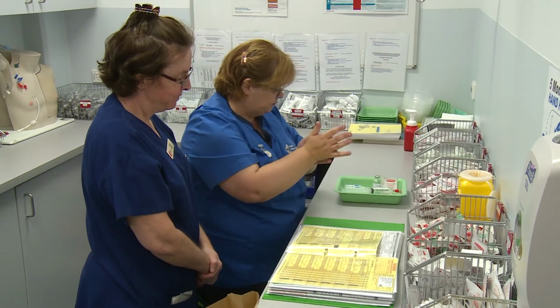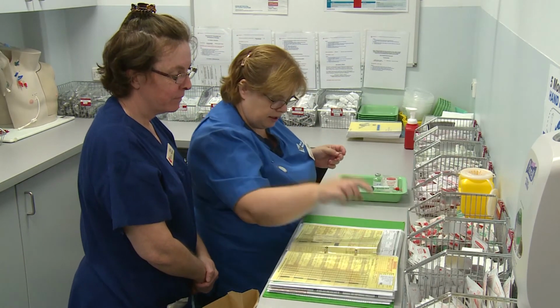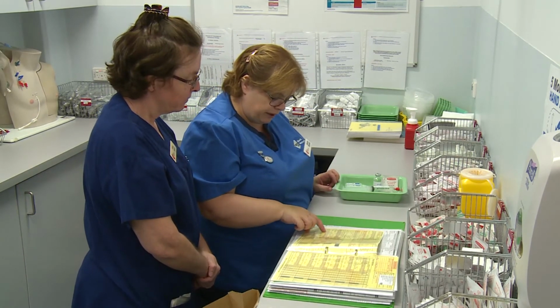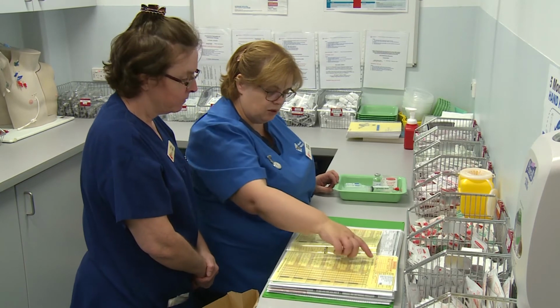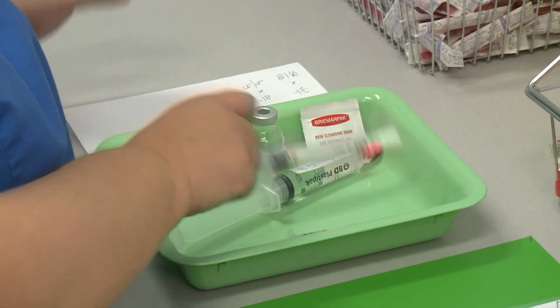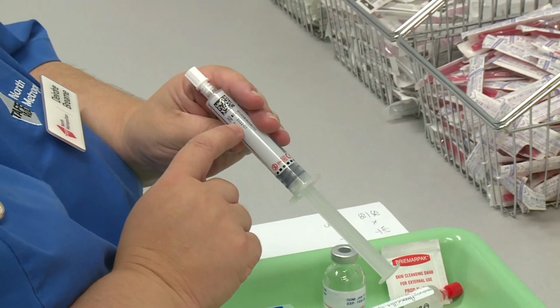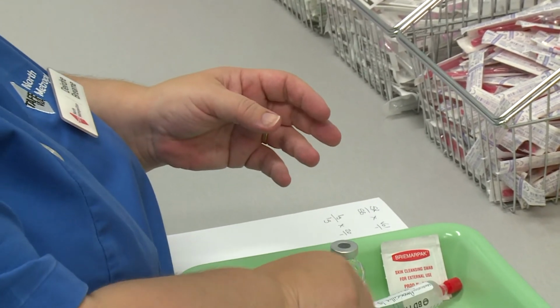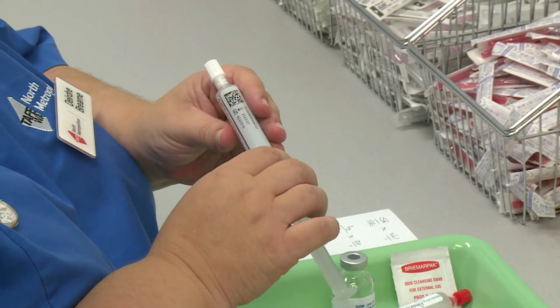Okay. So again, I'm looking after Thomas Hawkes. He is due amoxicillin 1 gram IV. It's due at 12 o'clock and it's been signed by the doctor. He's not allergic to it. So I'm just going to check my tray. So I have sodium chloride 0.9%, expires 2022. That's going to be my pre-flush. And my post-flush is going to be sodium chloride 0.9%, expires 2022.